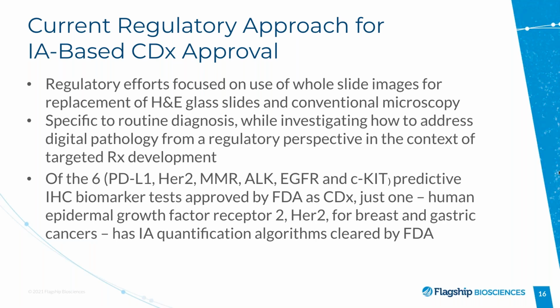Okay, so that's the background for either the traditional companion diagnostic or image analysis based companion diagnostic, and whether this can be verified by a pathologist or healthcare provider or not. So I think these gray areas will be worked out by regulatory agencies.